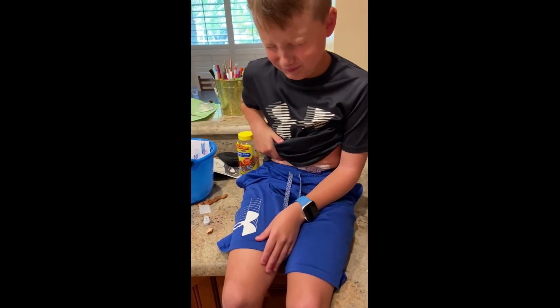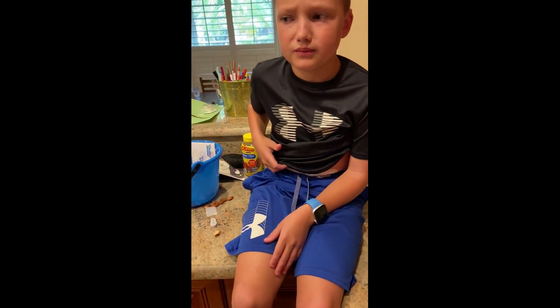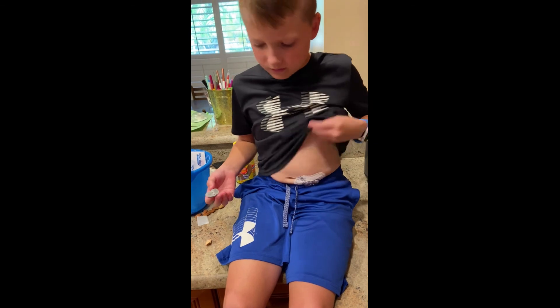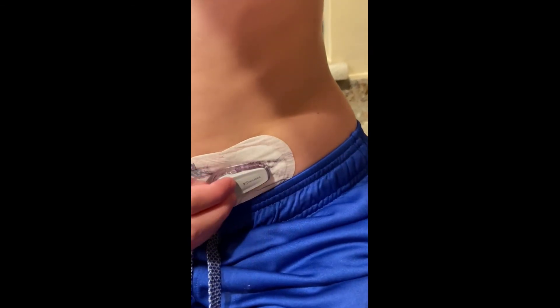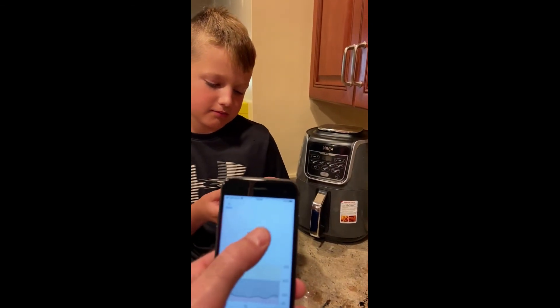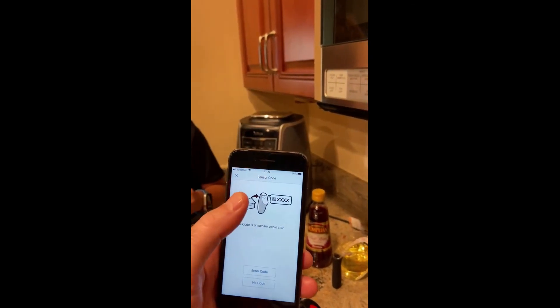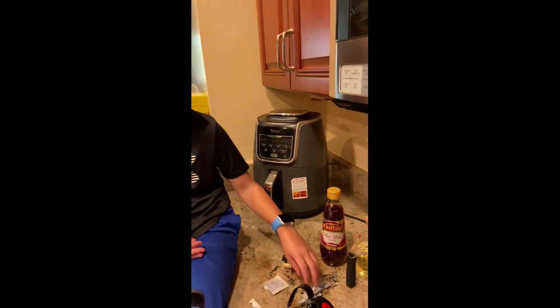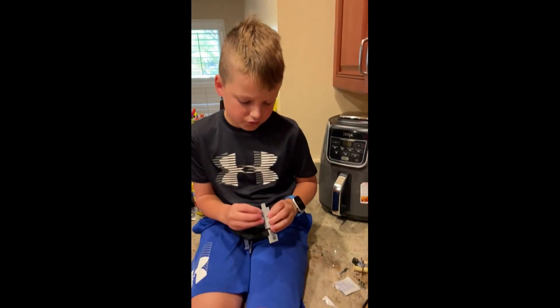Now we let it dry and then Abel's going to put the new transmitter in, and I'll show you on the phone app how we start his new sensor. So he's going to clip the one side in — and the two clicks. Now we're in. So now we'll come over here. This is the boring part — start the new sensor. Enter the code or I can do a manual. So anyway, I'm just going to enter the code and then it's going to take off. We hope that helps.